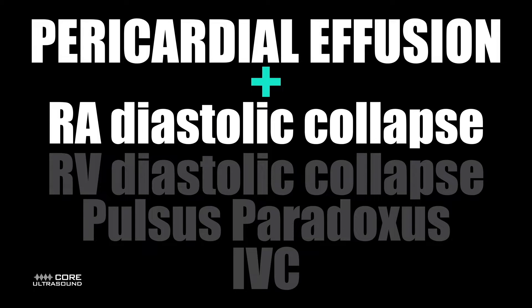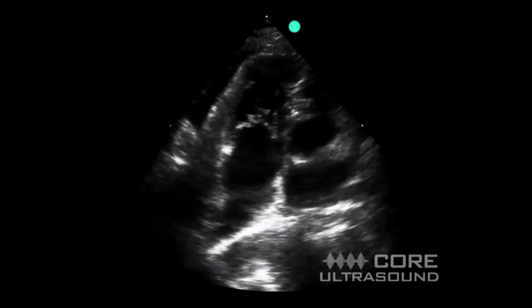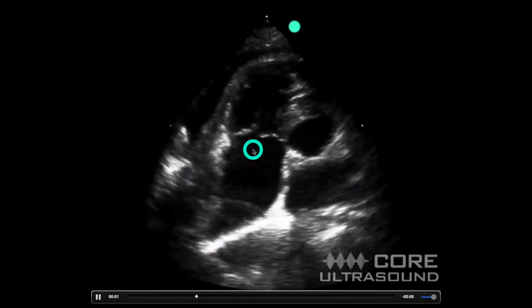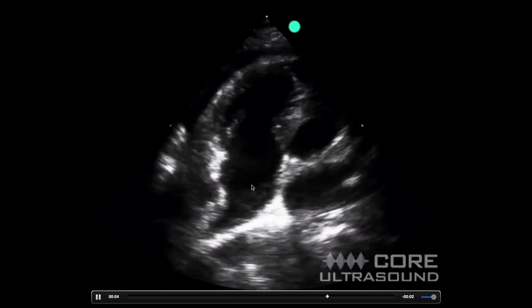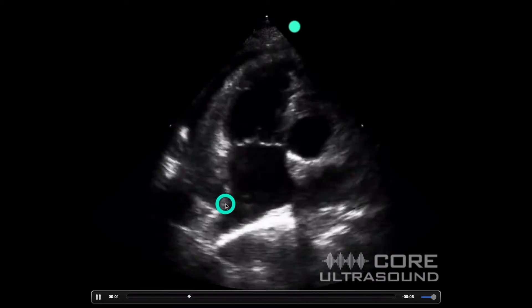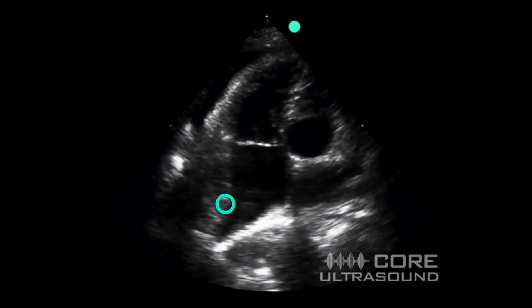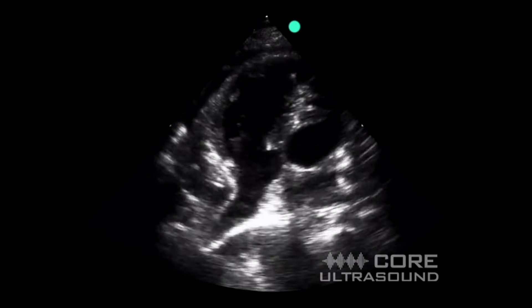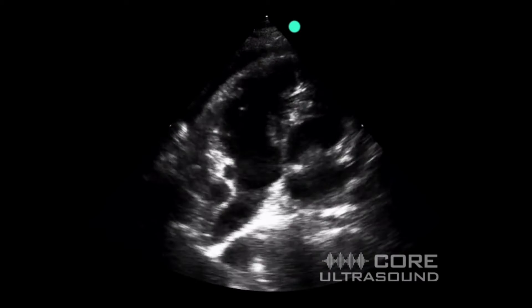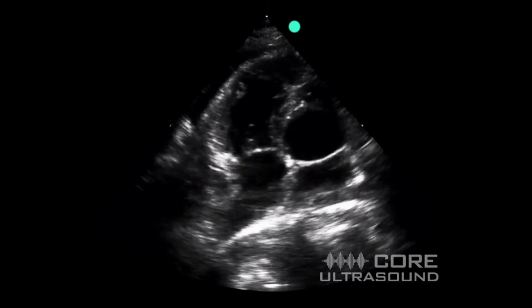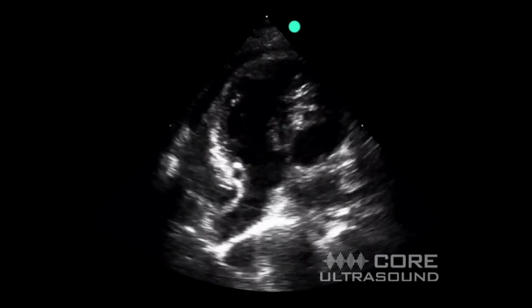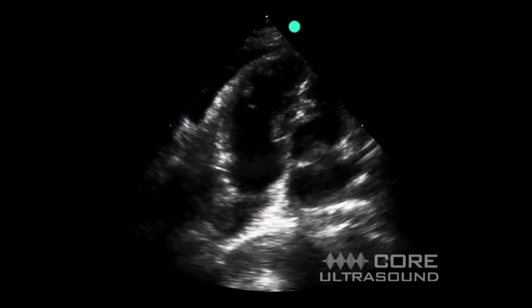Let's start with the earliest, most sensitive finding: right atrial diastolic collapse. The key here is to look at what the valves are doing. When you're looking at the atria, when the valve is open that is systole; when the valve is closed that is diastole of that chamber. You can do this on your machine by having the patient go through a few cardiac cycles, then hitting the freeze button and using the trackpad to cycle back and see when the chamber collapses relative to when the valve is open.